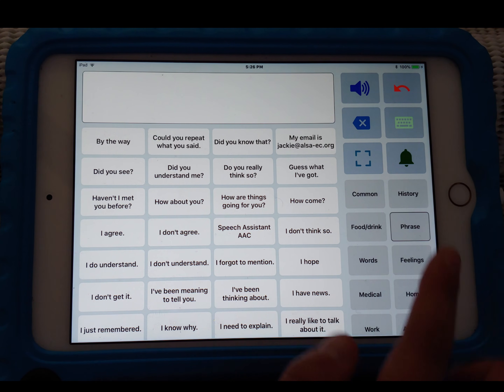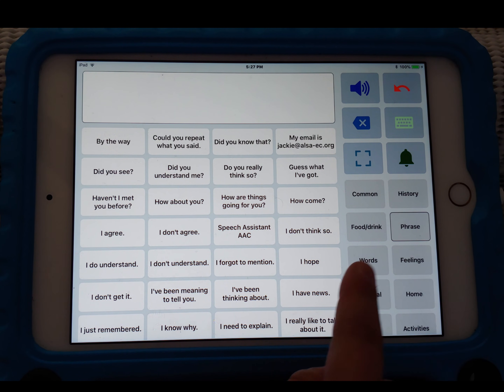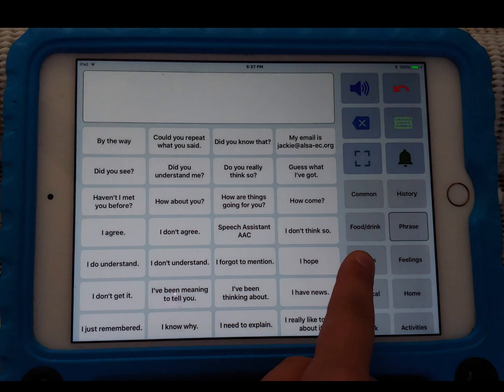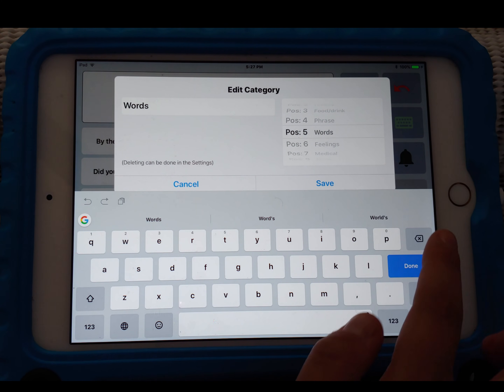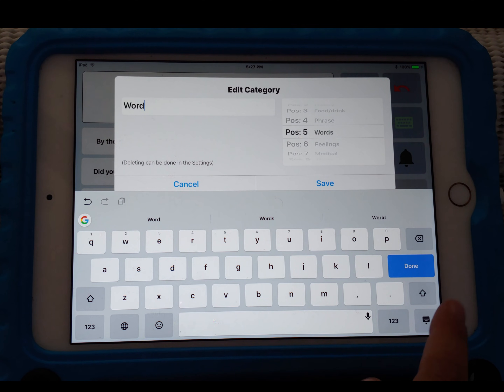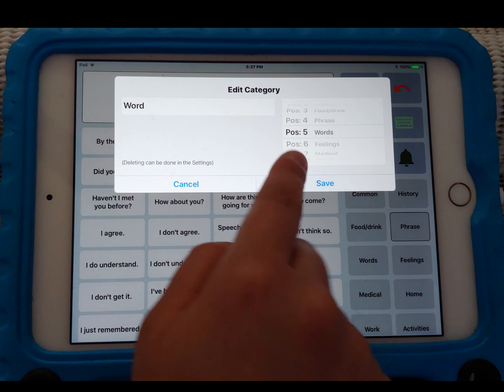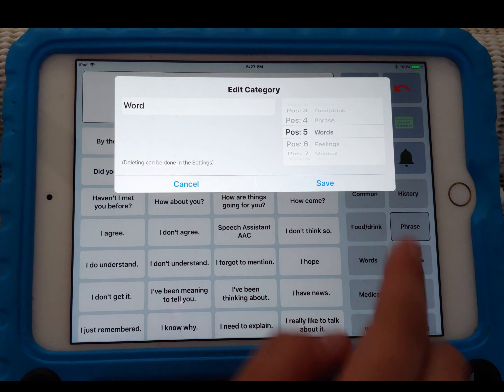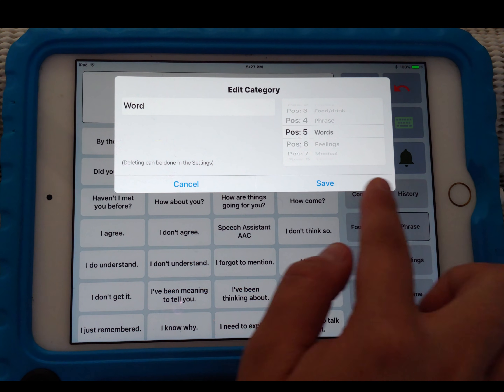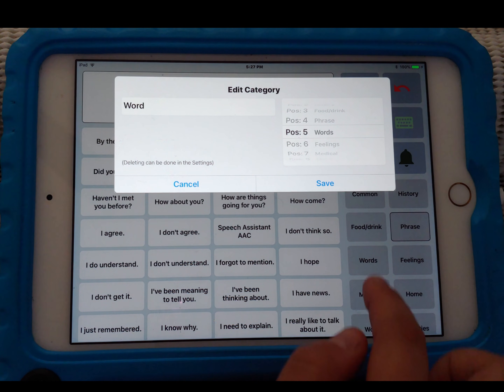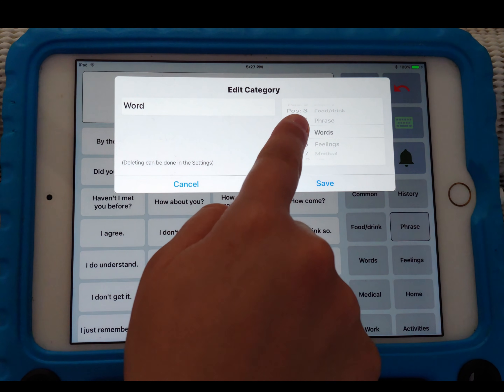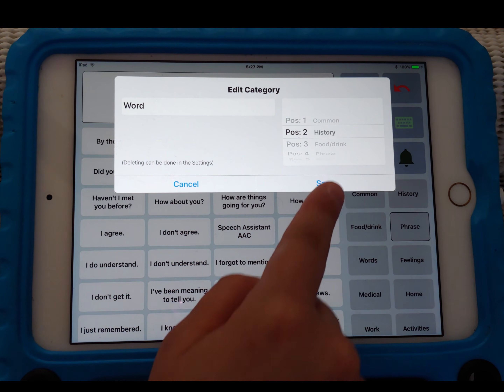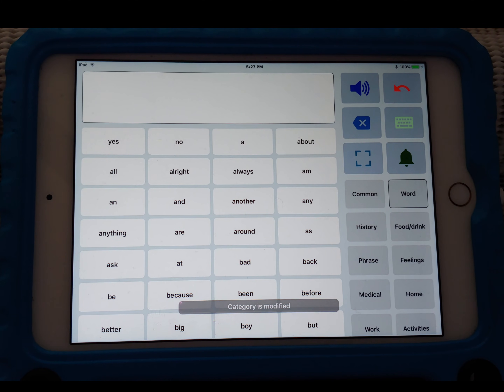It's the same process with categories as well. If you want to change words to something else, do that long press again. You can change the position of where the category button is located on the right side. So I'll move that to position two, hit save, and now we have that word in the second position.